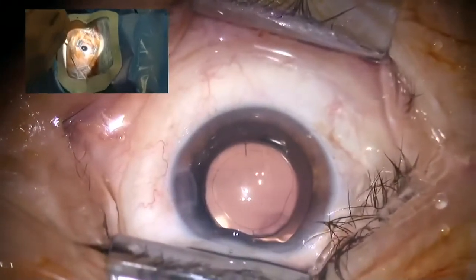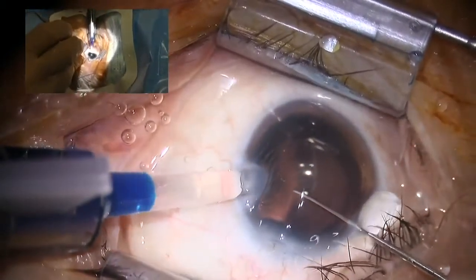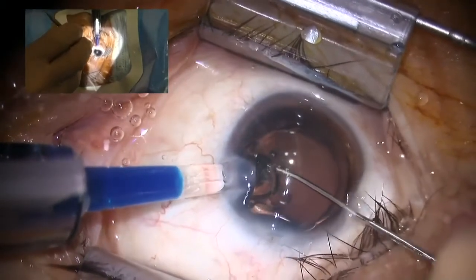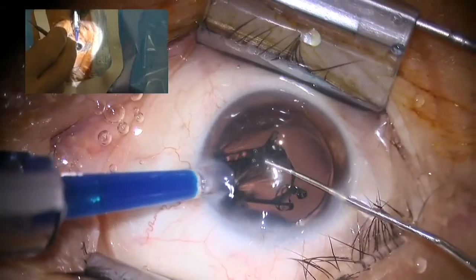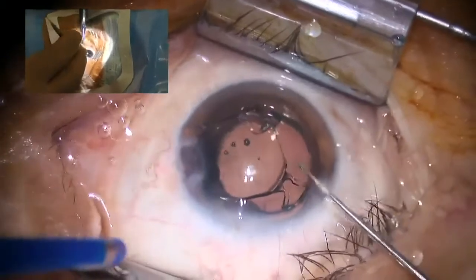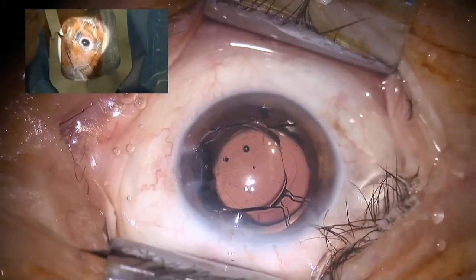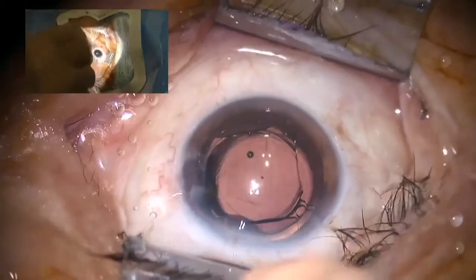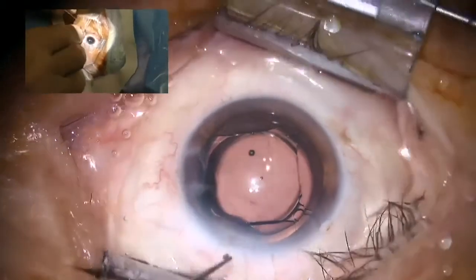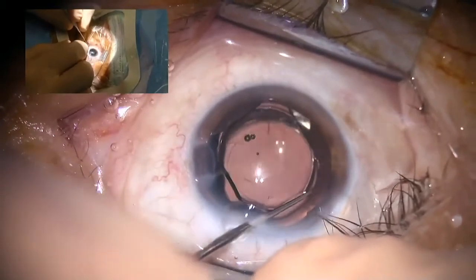I always use 2 instruments for the implantation, the push-pull and of course my injection system. This is on the one hand to stabilize the eye. The other reason you probably see now, because I go with my second instrument underneath the optic to lead the unfolding process inside the A.C. to avoid that the haptics go underneath. Now you see our first haptic is still underneath the iris. Now the second one can be very, very gently and easily pushed underneath.